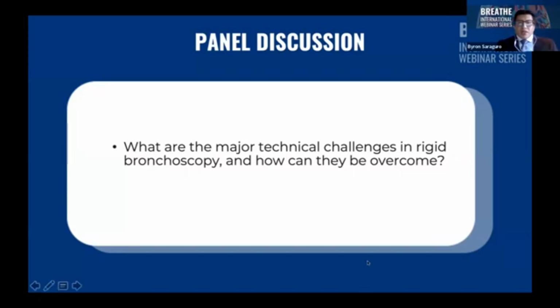It is very important to analyze each case before the procedure, including patient comorbidities, imaging studies, previous bronchoscopies, technical support, physical space, and equipment. It's imperative that the pulmonologists and the operating room staff be familiar with the necessary equipment. Each device must be properly organized and in good working order.